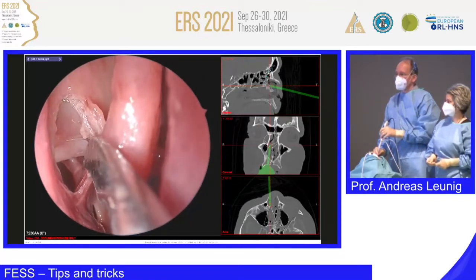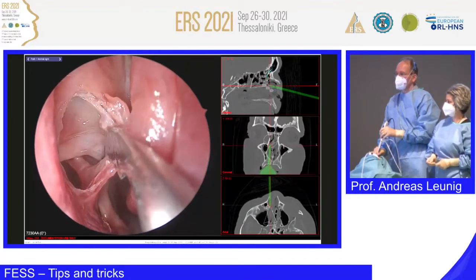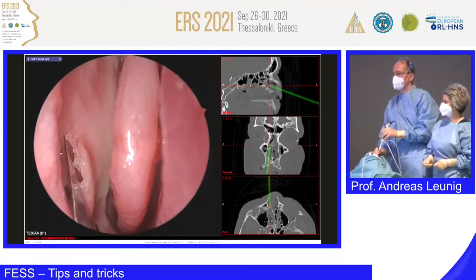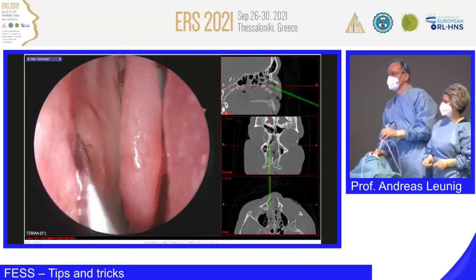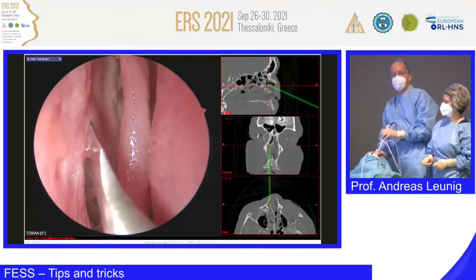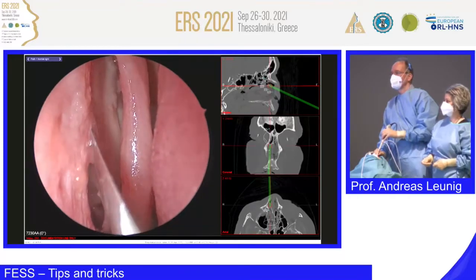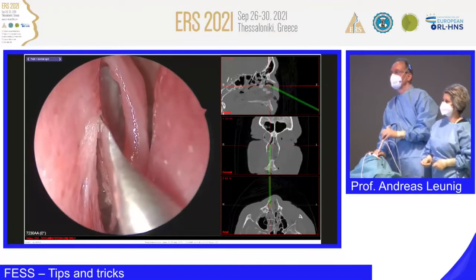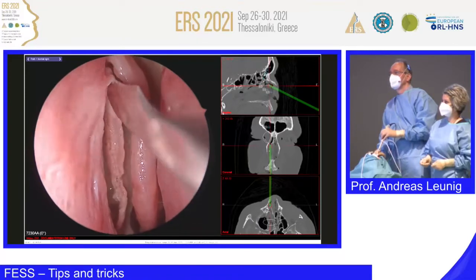So we gently, you know, pull a little bit, not too much. We want to be very atraumatic. We rotate the sickle knife. We're going high up. So step by step. And we are aiming in the direction of the axilla of the middle turbinate. We're trying to reach, but we are not trying to touch the axilla of the middle turbinate. So we want to be atraumatic, very gentle.